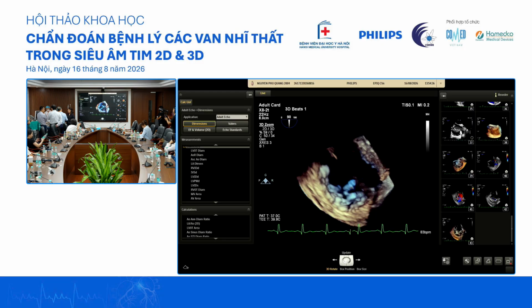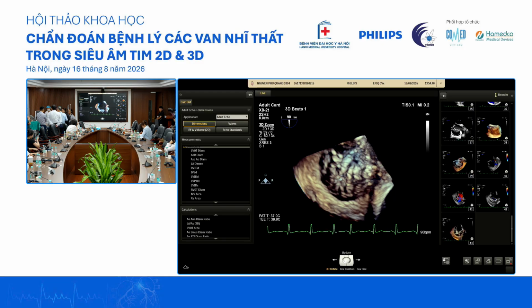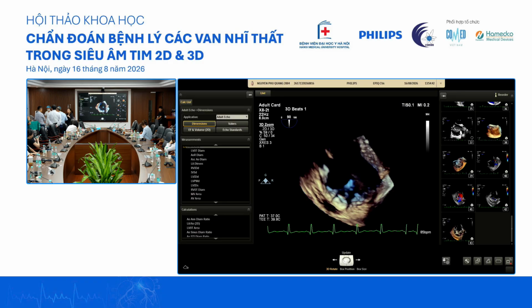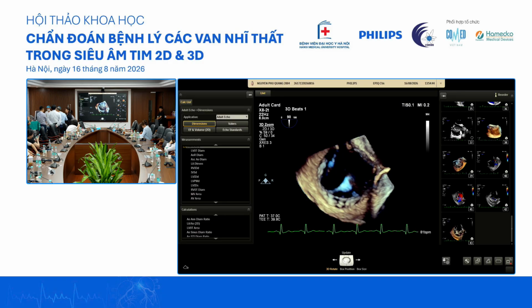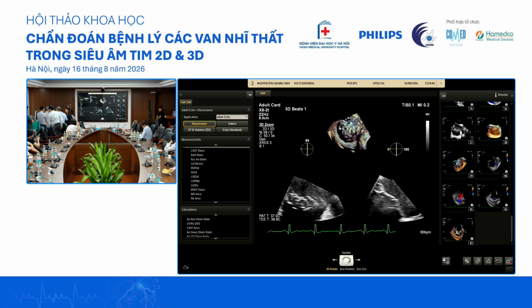When we click face crop, you should be able to bring that plane now. You can keep this one. Or you can open in 2D and then you can see where you're cropping. Yeah, so he cropped it. Oh, that's okay.